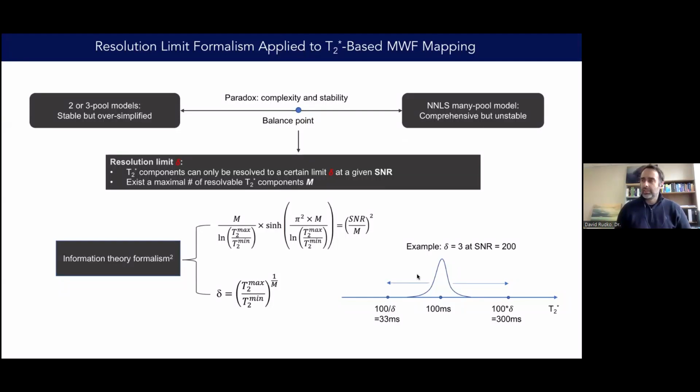And Vlad's data, for instance, was fixed brain tissue. So there's this phenomenon in the fixed brain tissue where what we saw was that the T2 star relaxation of the myelin water was a little bit closer to the intra and extracellular water in some cases.